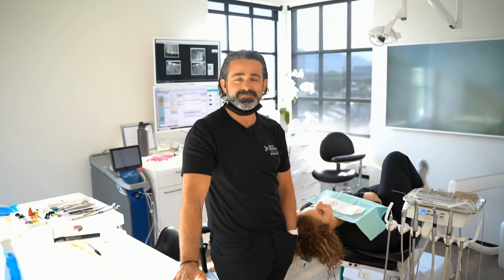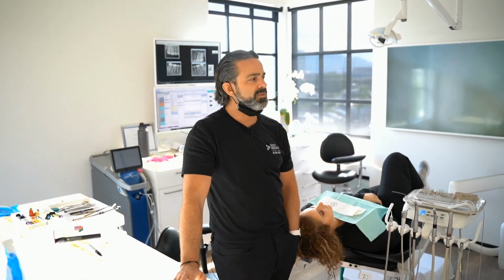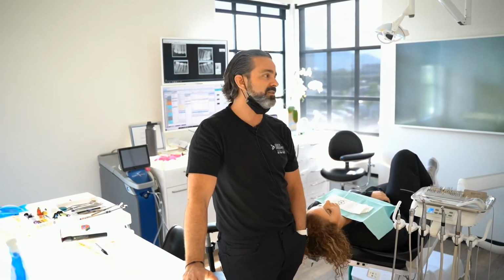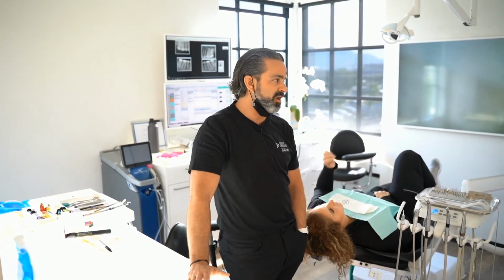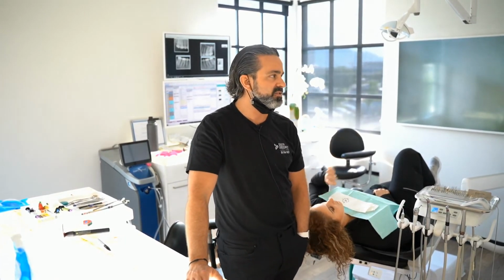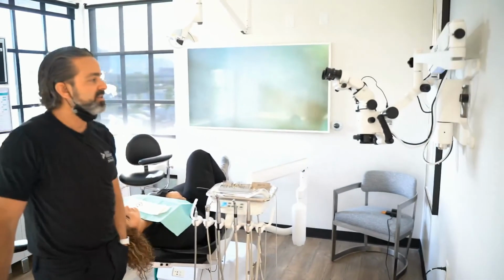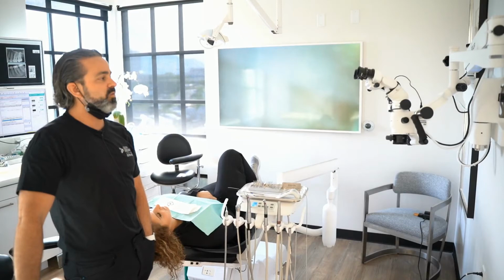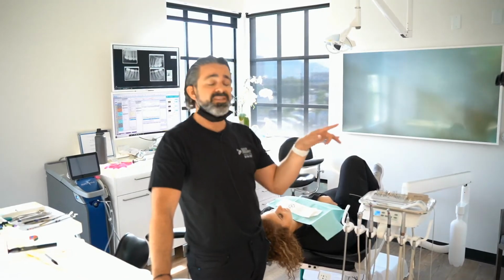Anything else? Any pitfalls to avoid, or any mistakes that you made on early microscopes that could help? Well, the microscopes have definitely gotten better. Believe it or not, having an arm that can balance and stay balanced speaks volumes to what's really going to frustrate you or not. Ergonomics, understanding the details of these ocular extenders, understanding the methodology behind beam splitters. You can make mistakes without experience in that, and hopefully me talking out loud lets you see how my brain works and why some of these details are important.